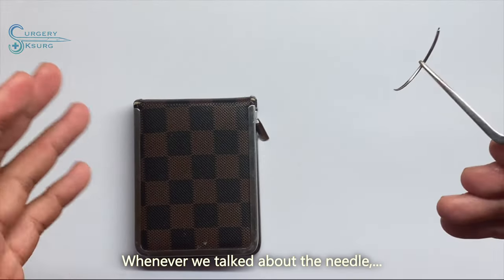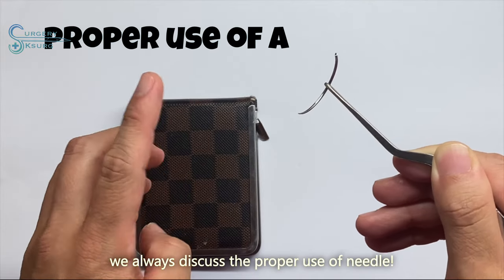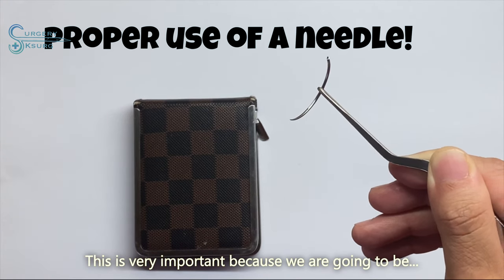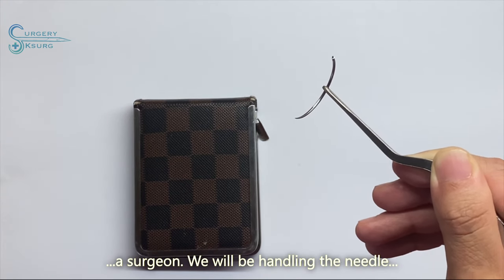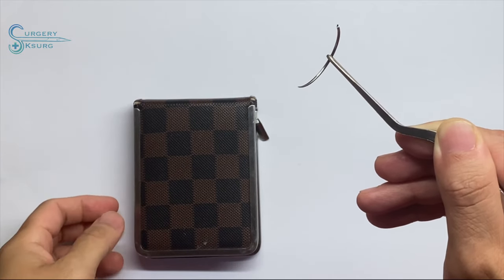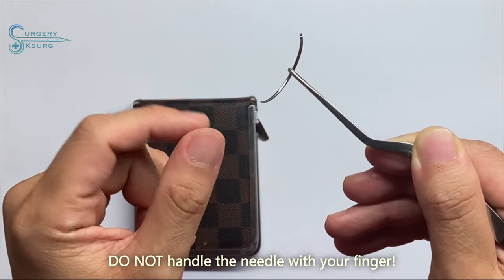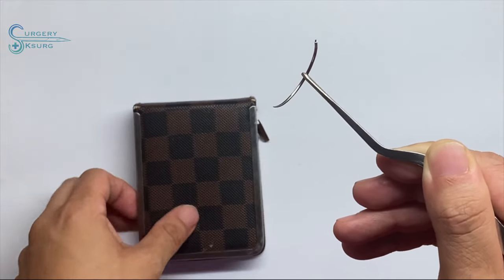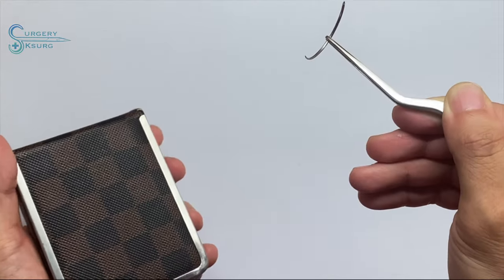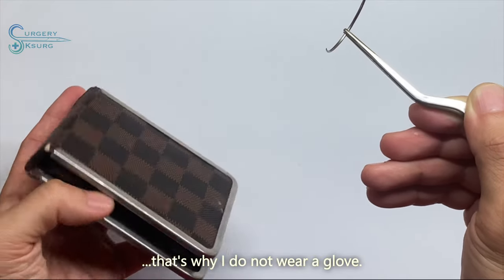So where do you find all this needle information? It's all here. Whenever I talk about needles, we always talk about the proper use of a needle. This is very important, because as a surgeon, you are handling the needle day in and day out. Of course, I always nag: do not handle the needle with your fingers. I have to highlight again, I'm in my studio and we are not doing any surgery, so that's why I don't wear a glove.